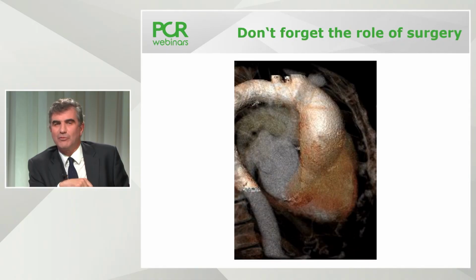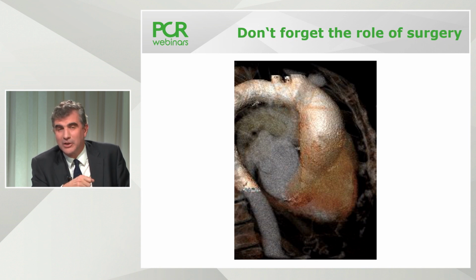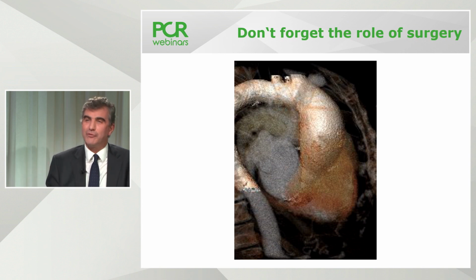And that's particularly relevant, of course, when we start to talk about patients with associated anatomy. So here's a nice volume rendered CT image of a patient with a relatively large ascending aortic aneurysm. And we can't deal with that by means of TAVI. So we need to remember that the surgeons have expertise beyond what interventional cardiologists can offer. And the same is true if you have a heavily calcified bicuspid valve and very complex coronary artery disease. It may well be that the surgeon will do a better overall job than even the most skilled interventional cardiologist can achieve. So we need to remember that as well.